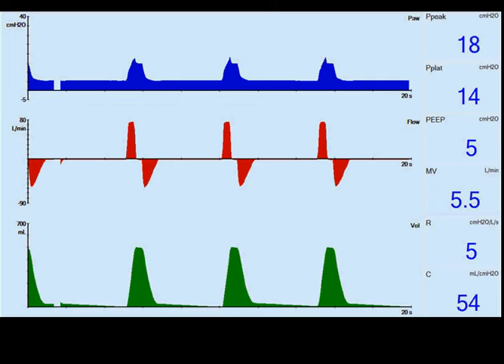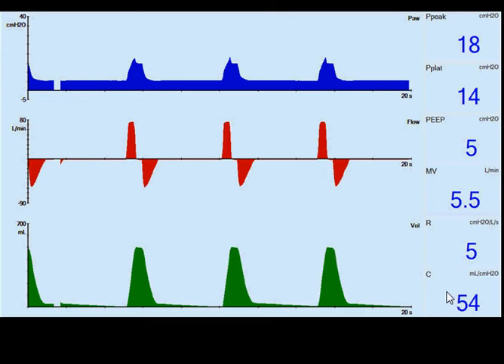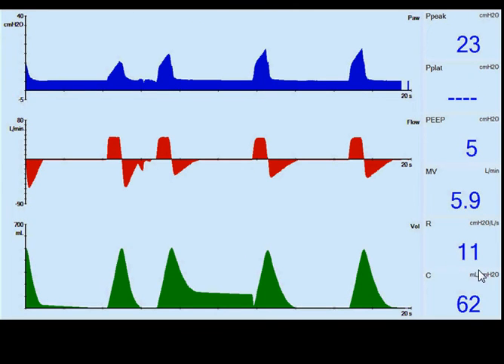This next slide is another demonstration of a resistance change and how it affects volume ventilation. Our current peak airway pressure is 18, minute ventilation is 5.5, resistance is 5, and compliance is 54. When we increase the resistance to 11, peak airway pressure increases, but the flow waveform stays consistent.